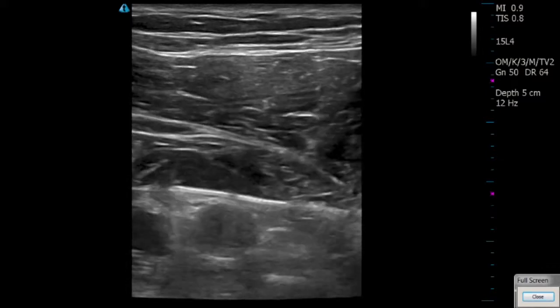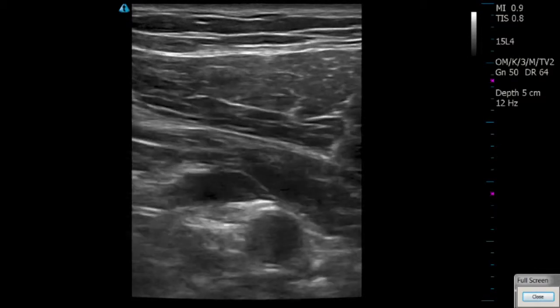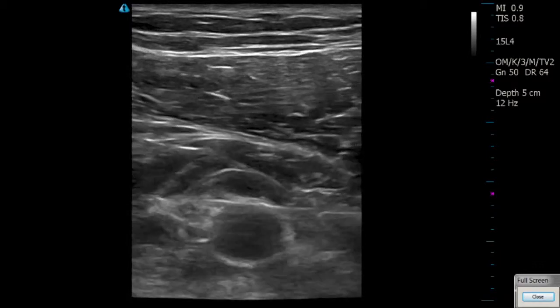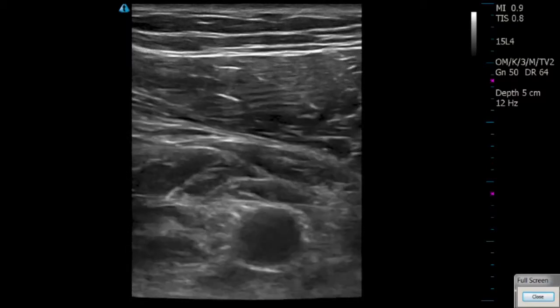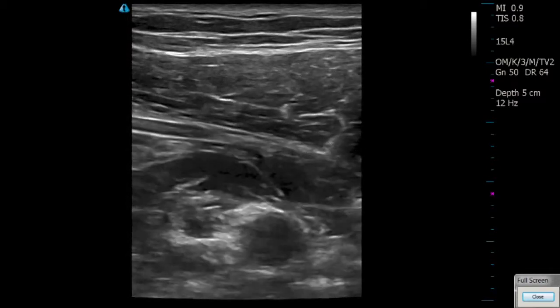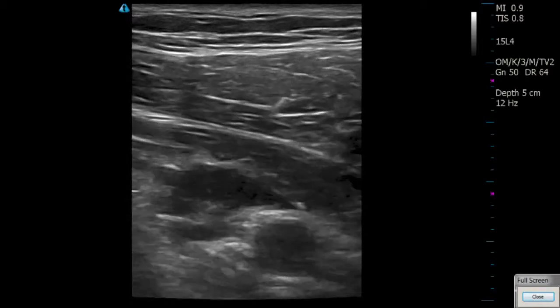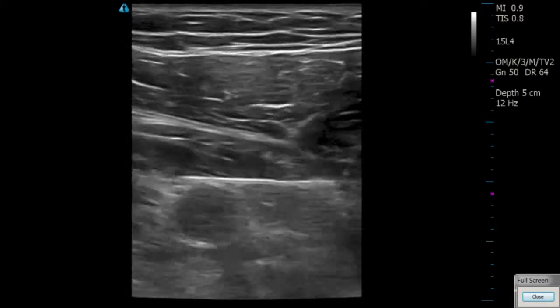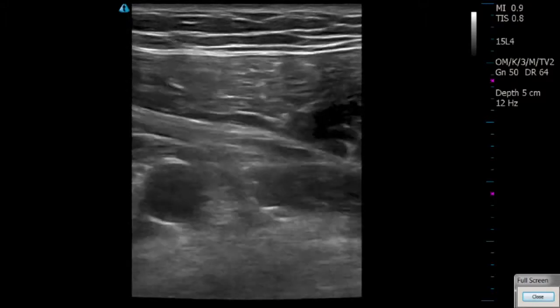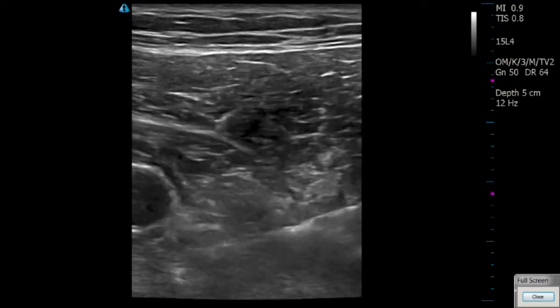Steepening as I go. No longer terribly concerned about the stimulating current — I'm focused on visualization just deep to the needle. That's a total of 20 cc's. Give another five cc's there — total of 25. I have five cc's left. You can see, going slightly off-plane with the needle, some pretty clear nerve tissue with better contrast now, with black local anesthesia around it at about the ten o'clock position. To complete the block, I'm going to target the lateral cord, which appears to have nerve tissue a little more lateral on the right side of the artery.